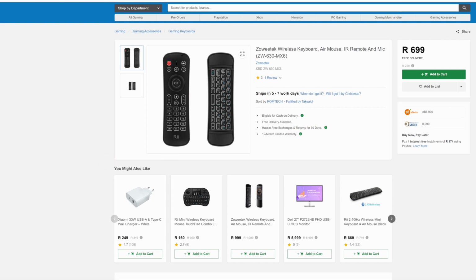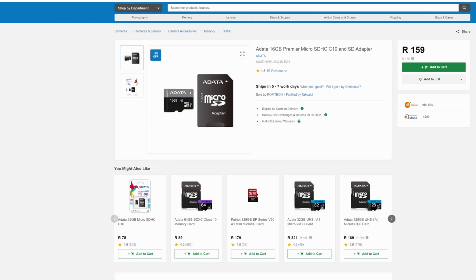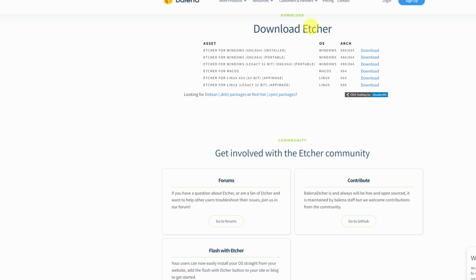And then you'll need an SD card. So, I mean, you only really need a 4 GB SD card. Those actually aren't that common to get nowadays. So, I mean, you can pick up a 16 gig SD card relatively cheap. If you buy them in bulk, you can get like a set of 10 even cheaper if you're running multiple monitors. Again, I'll put all the links in the descriptions for these ones, but you can buy any SD card will do. Then to put the software on, you'll need something like Etcher.